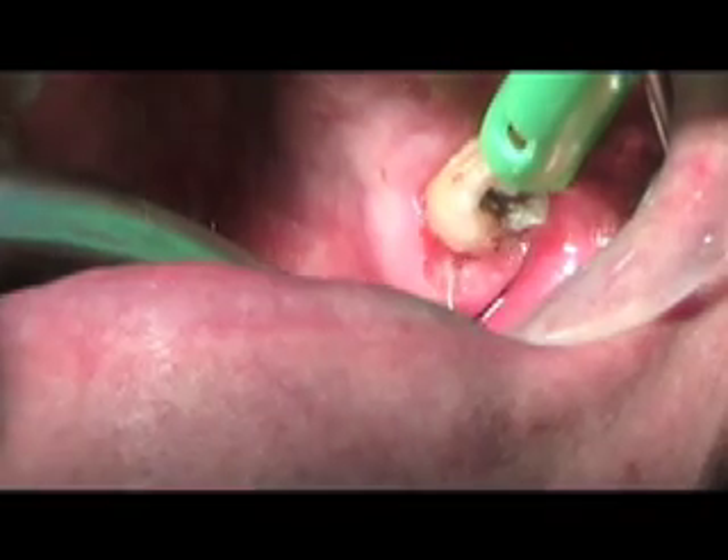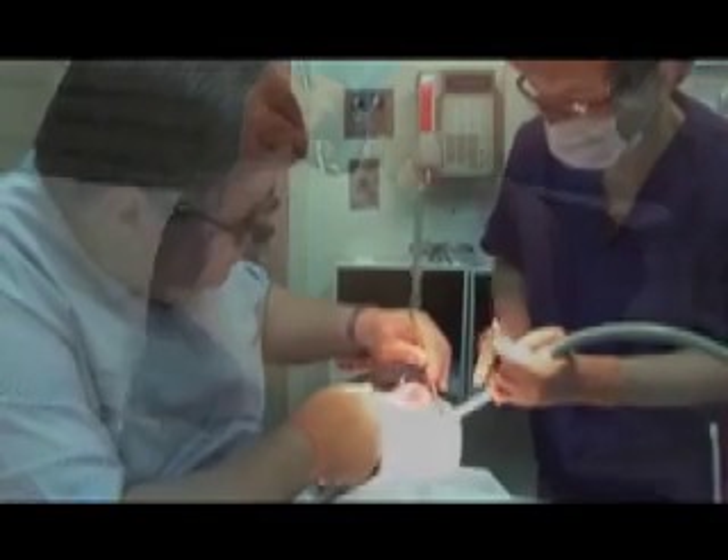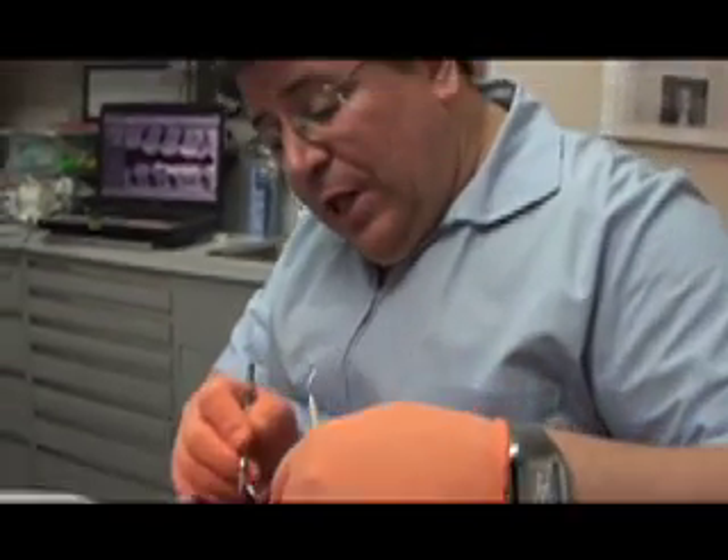For many of my patients we're able to remove decay using the laser rather than using a conventional drill, so there's no vibration, no sound — nothing to disturb the patient other than a slight sound of popcorn going off in the background.